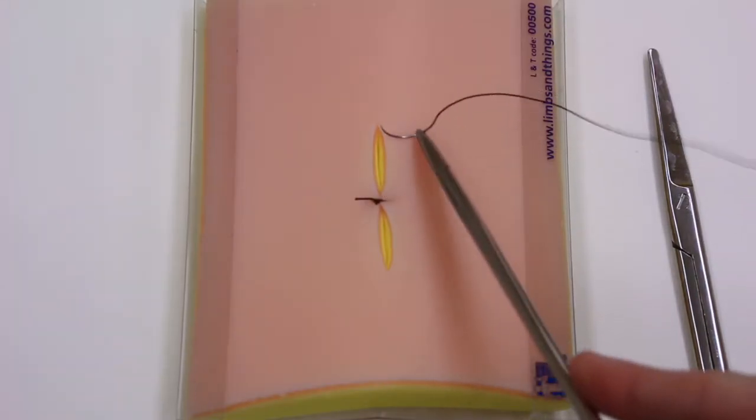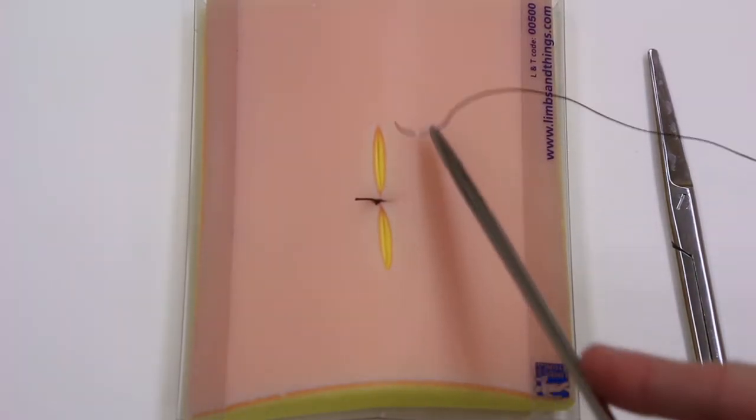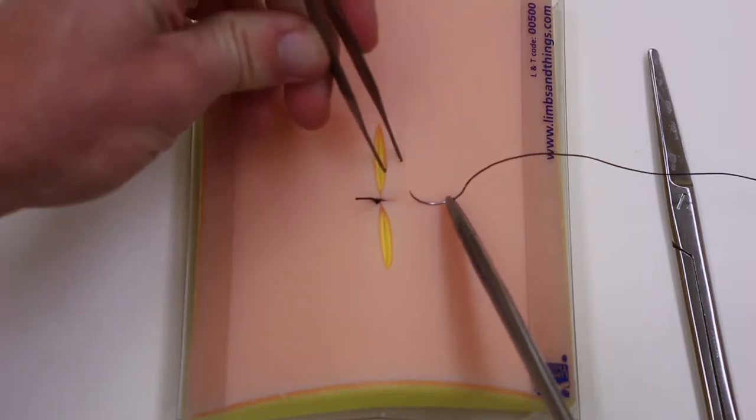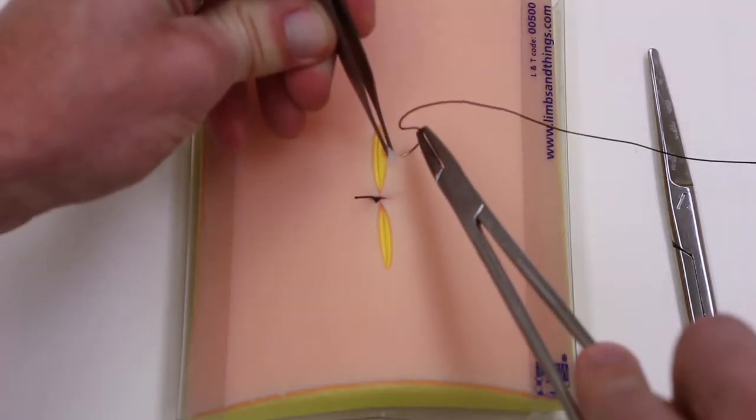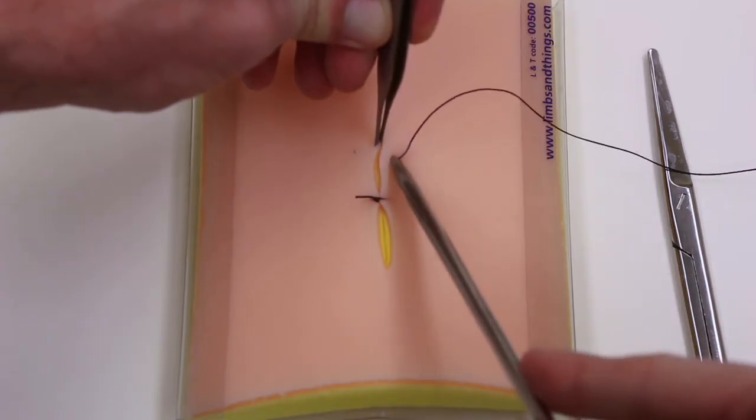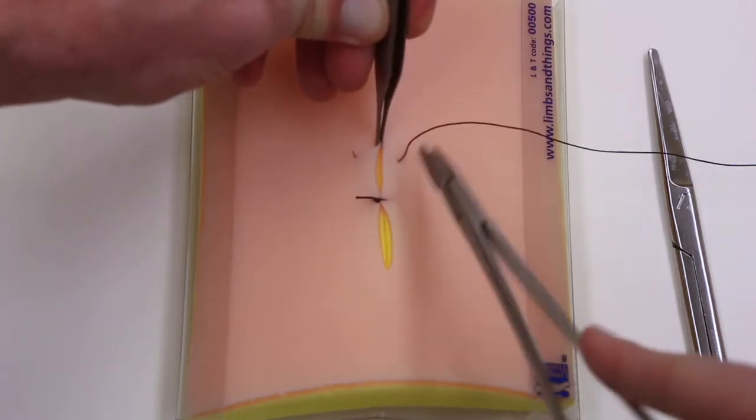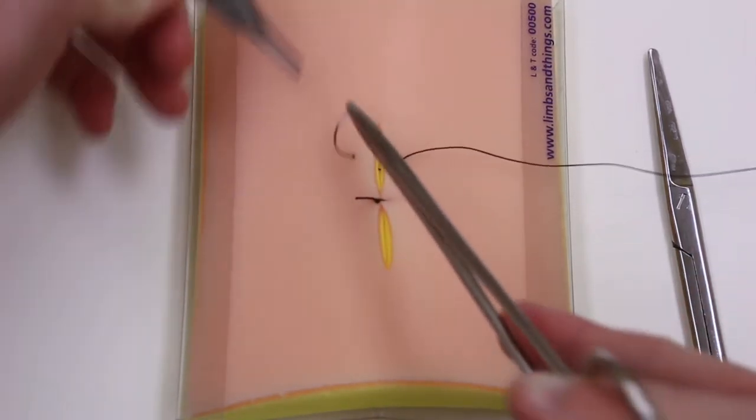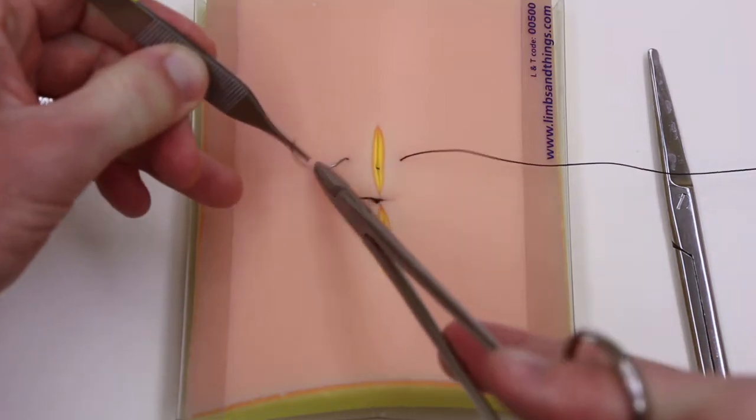Taking the remainder of the incision, splitting it in half. Needle in, rotating through, following the curve of that needle. You'll see once it's closer together, you can take it in a single bite.